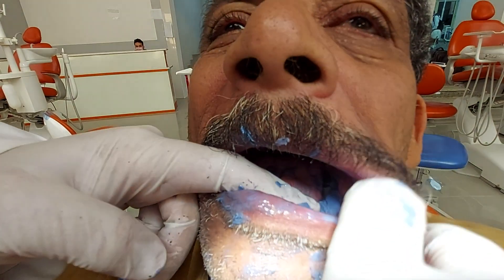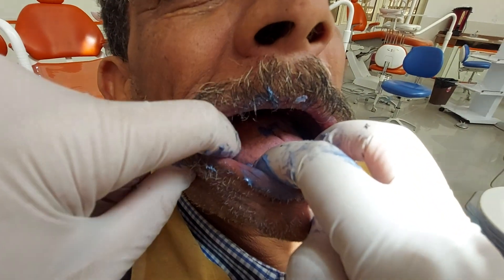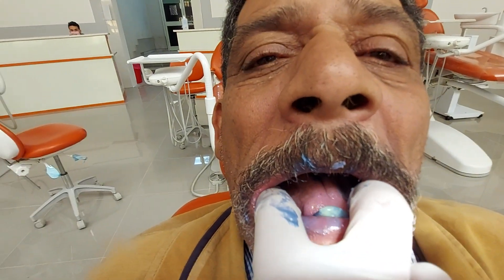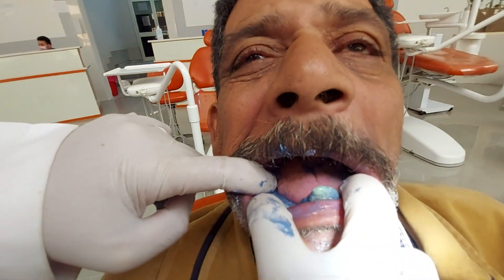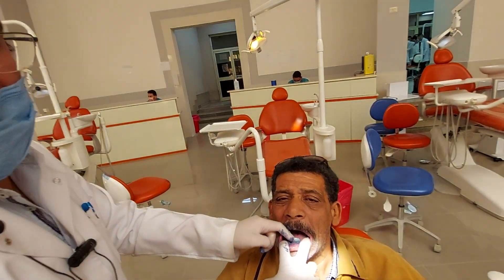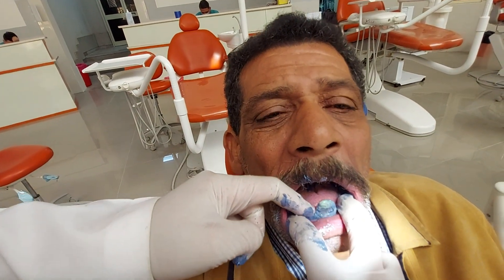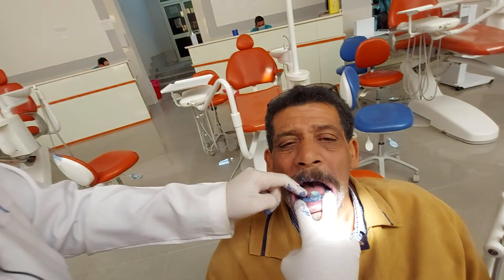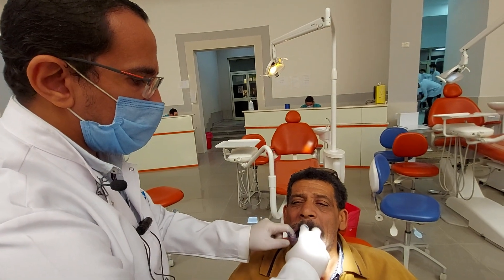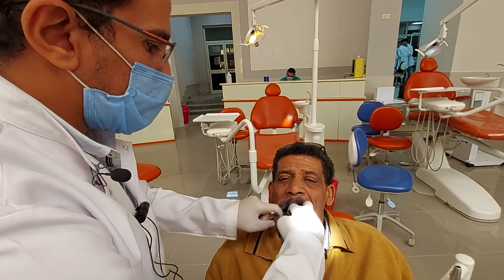I keep border molding the material until it starts to set. I wait until the material sets by checking the material inside the patient's mouth — any excess material I will check to determine if it has set or not. As you see, the material is still soft; I touch the material and it's smooth, which means it hasn't set yet. It takes about four to five minutes until the material sets inside the patient's mouth.